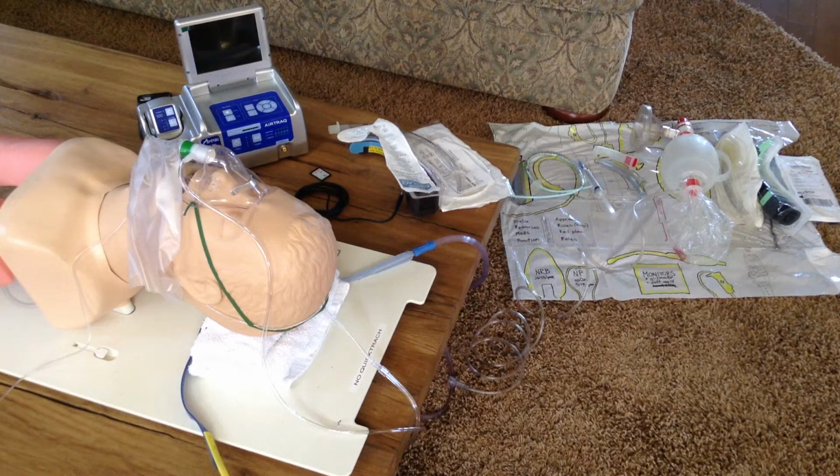The patient is positioned ear to sternal notch with face plane parallel. Head of the bed is elevated. We've identified our resources and defined roles. We've planned out as a team our medications that we're going to use, what approach we're going to take, what anticipated risks there might be, and finally we've determined a failure plan.